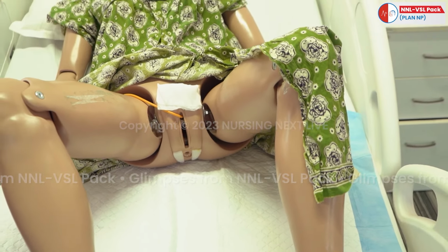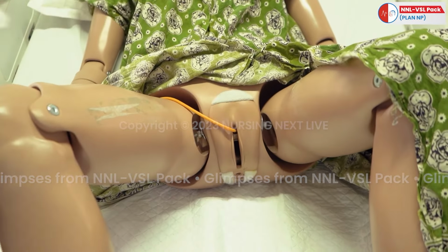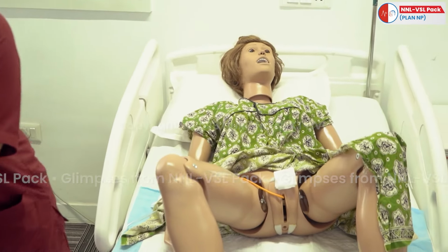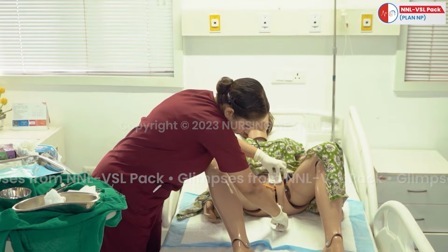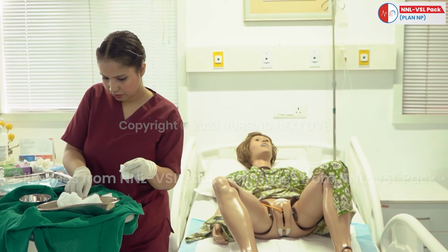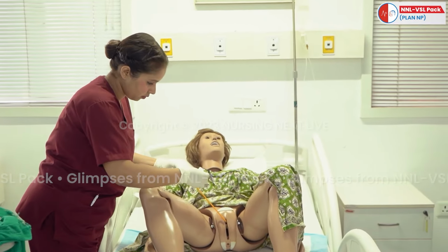Same way, pat dry. Hold the catheter with the non-dominant hand and with the dominant hand clean with normal saline from inner to outer in rotatory motion.